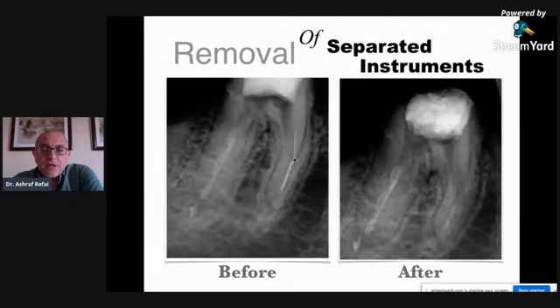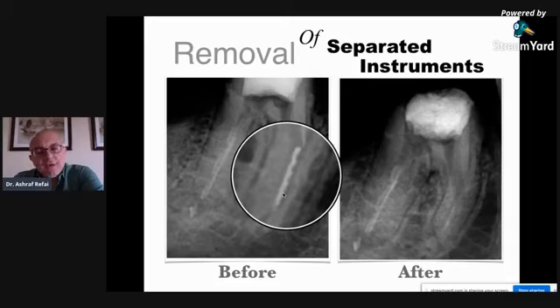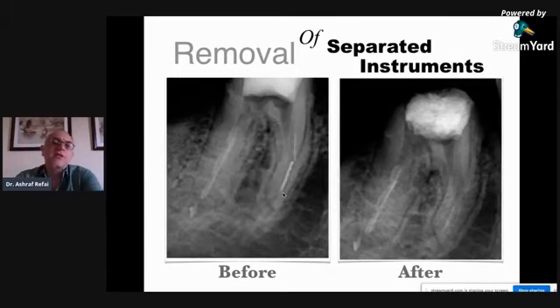Now, this was an example of a tooth with an instrument separated. It looked like an H file. It's very obvious. I'm just going to blow it up here. You can see the typical H file shape. And if you look very closely, you can see that there's actual space between the instrument and the canal. And this was the case when I looked down into this canal with my scope. I could see a lot of space, and I spent about 2 or 3 visits trying to remove it, and I failed.